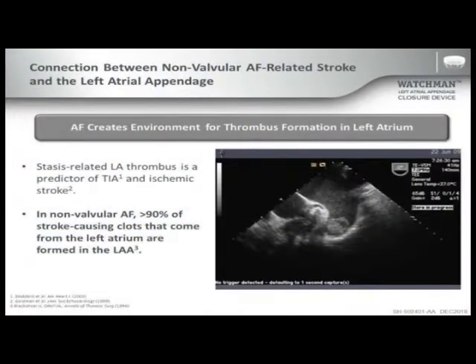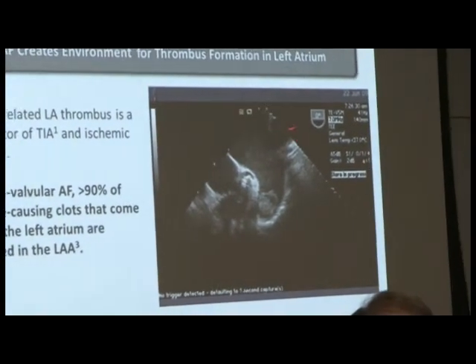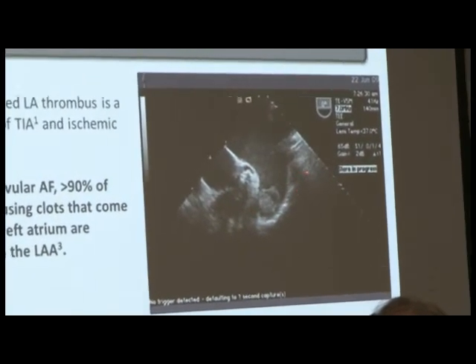So in atrial fibrillation, about 90% of all strokes, TIAs, whatnot, are caused by clots in the left atrial appendage. So this is, of course, the most egregious and obvious example of a left atrial appendage clot ever. But this is a transesophageal echo. So the echo ultrasound probe is actually put in the esophagus because the esophagus actually touches the left atrium, so we get beautiful views of the left atrium. And you can see, there we go. So this is the left atrium here. This is the left atrial appendage.